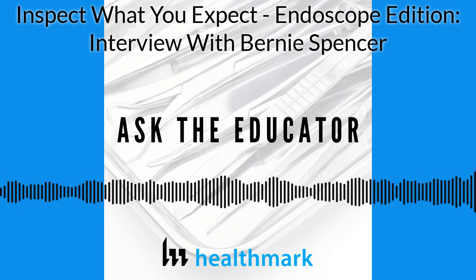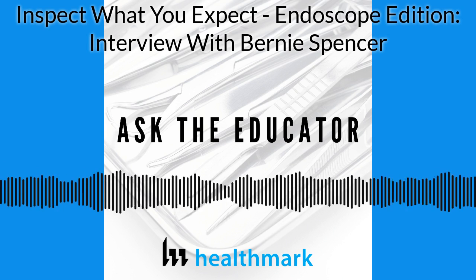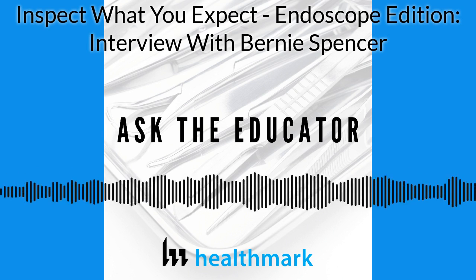Excellent. So with that being said, I do want to let you get into your results. I apologize for interrupting. But yeah, so 800 endoscopes tested. And then what did you find out? One of the main things I found out, in my opinion, is that visual inspection of the brush is not a good indicator of whether or not the channel's been adequately cleaned.